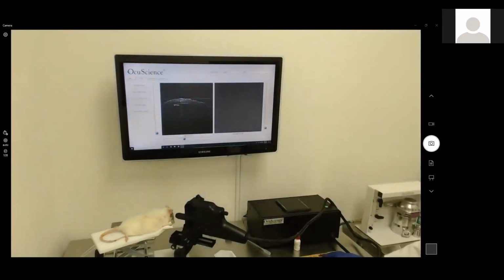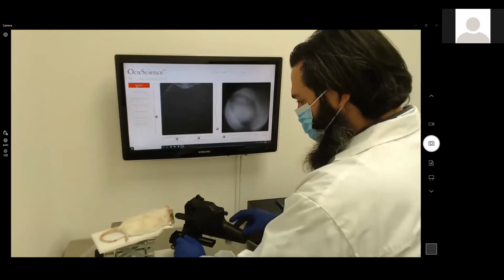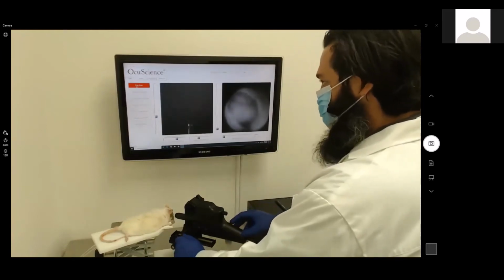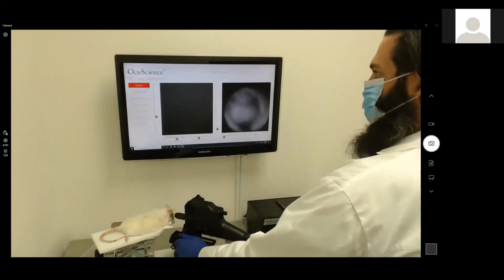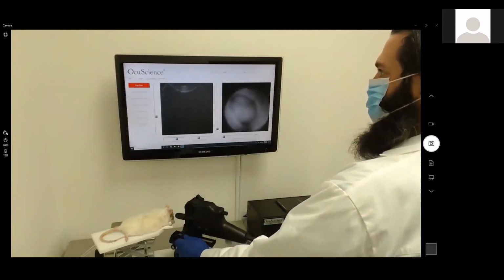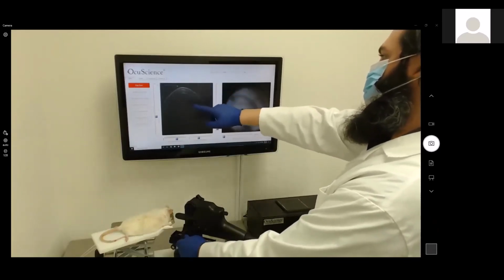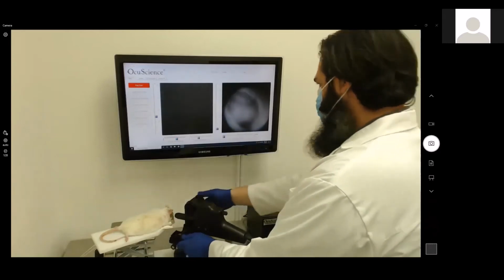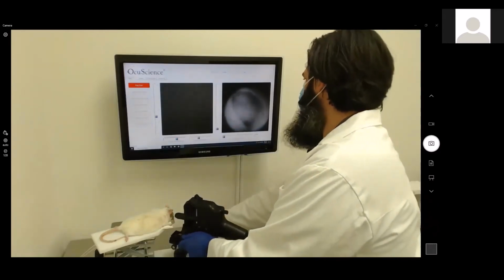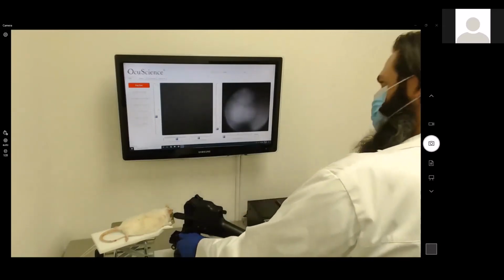So I will go back to our scan here. And now simply with this, we can move this forward. Our OCT moves towards the eye. Other OCTs move the eye towards. Notice the rolling of the image going to the top and then back down, as Jill probably has mentioned a couple times in her discussions. You can see that action occurring. And as you continue into the eye, you'll see it roll down off the screen. Now, sometimes that rolling down image can create an artifact depending on what you're looking at.